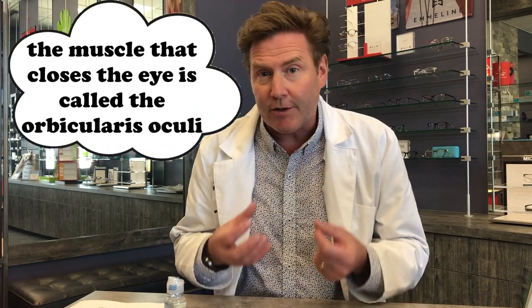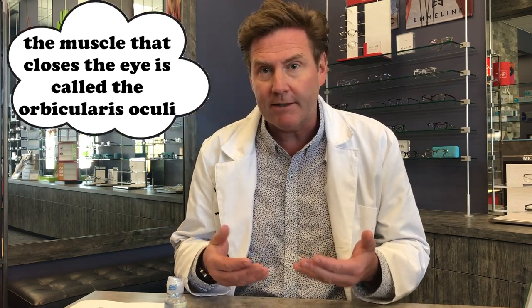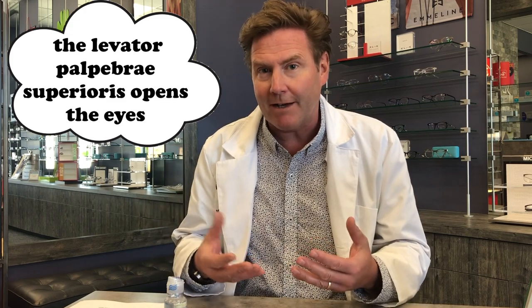The key to putting contact lenses in is being able to hold your lids. Your lid muscles are extremely strong and we have a very strong blink reflex to prevent us from putting things in our eyes. So you have to learn some techniques and skills. All the instructions I'm going to give you assume that you're right-handed; if you're left-handed you can just reverse the instructions.